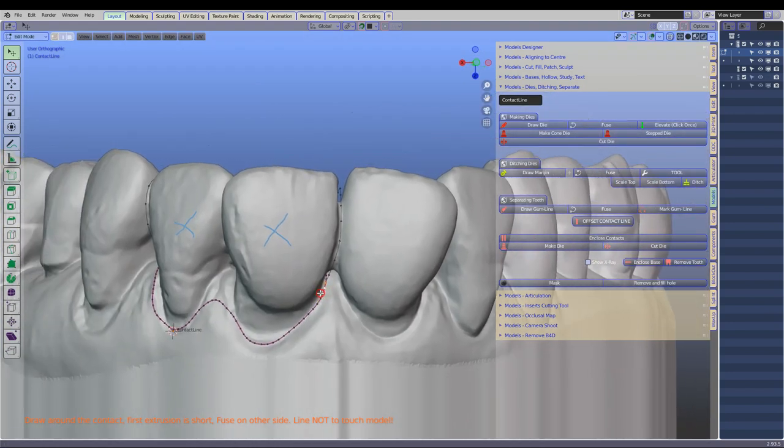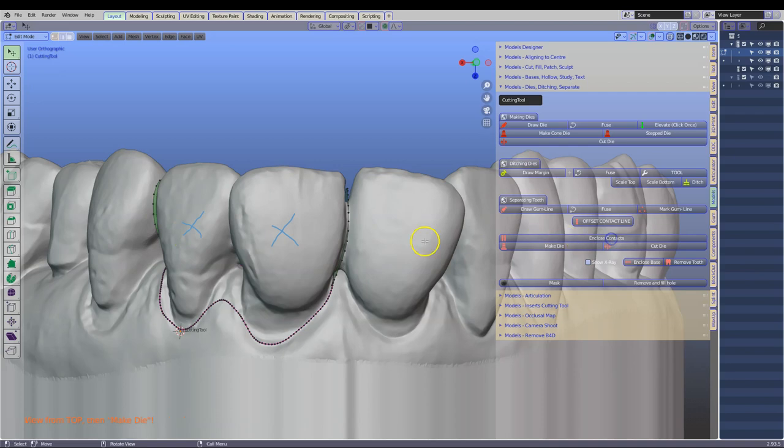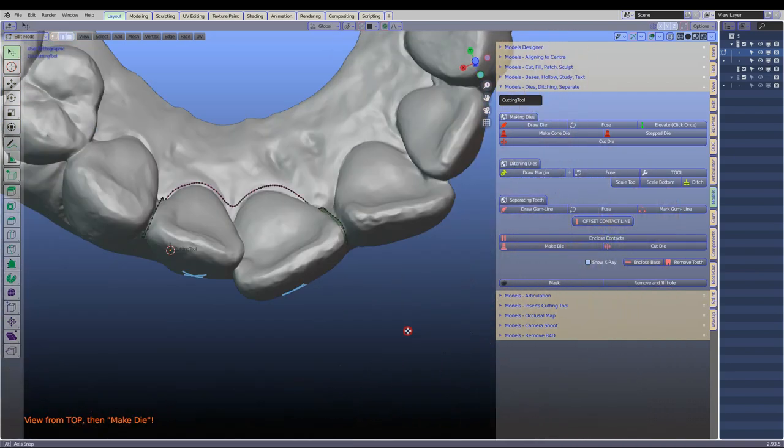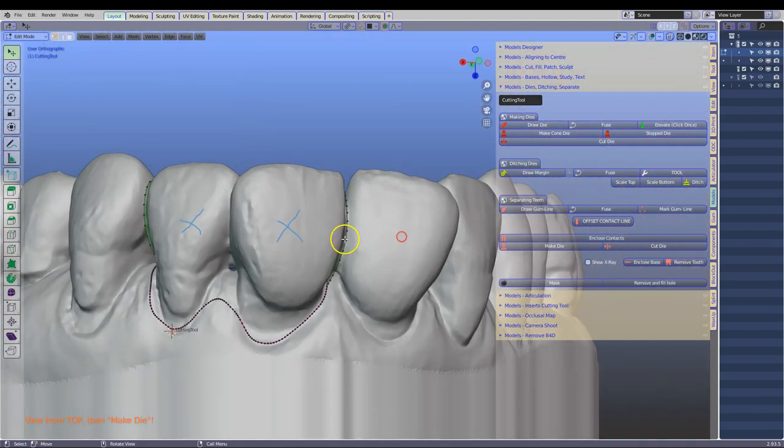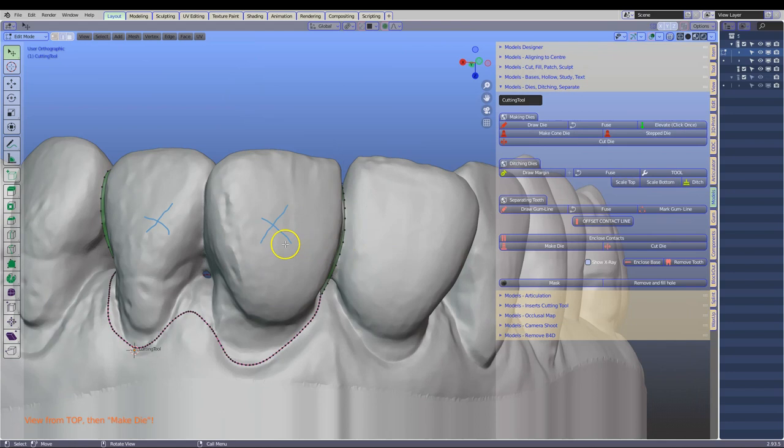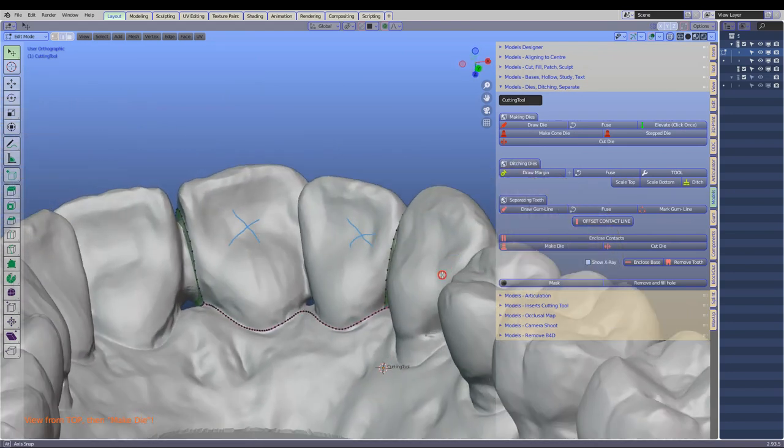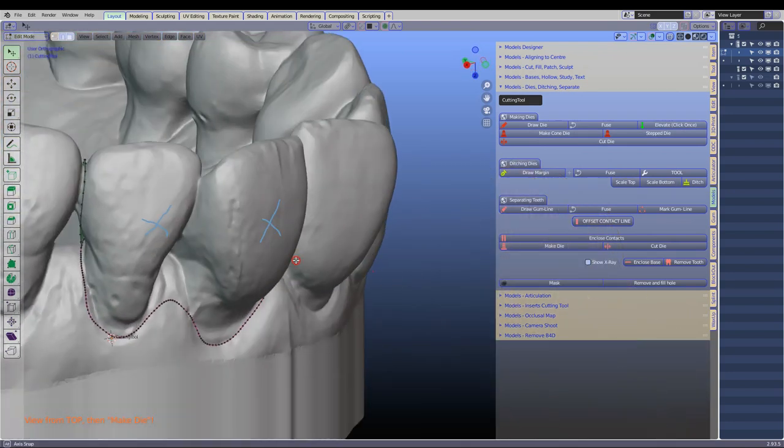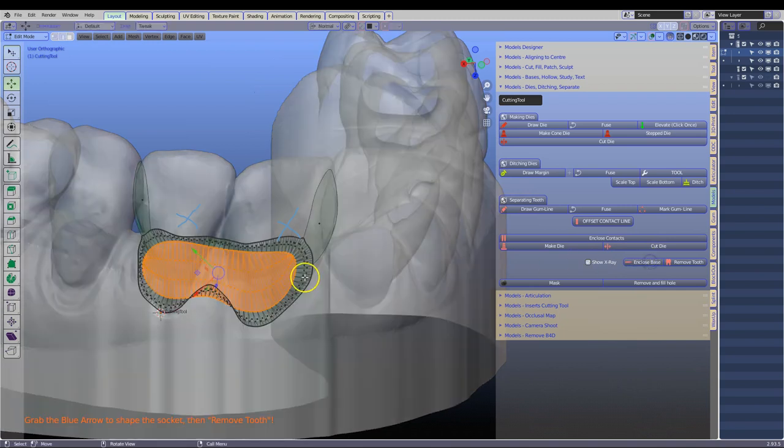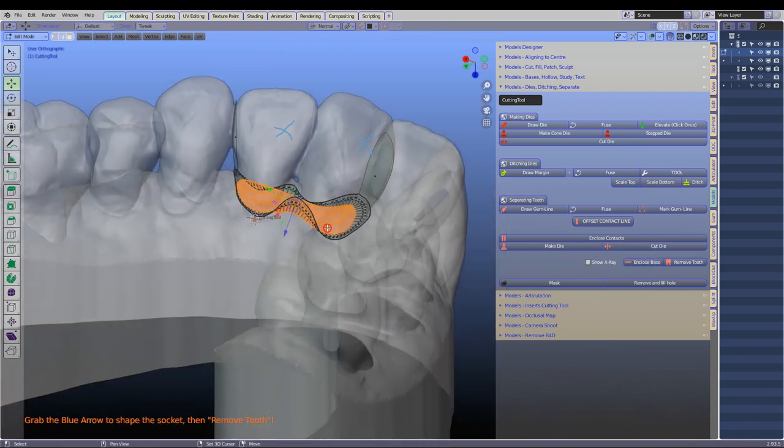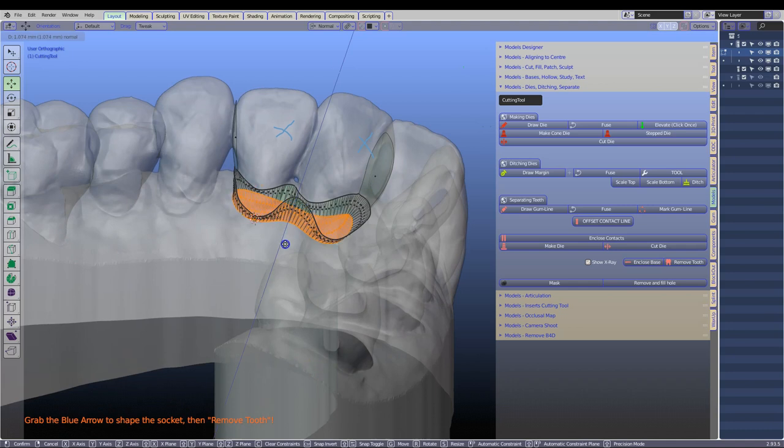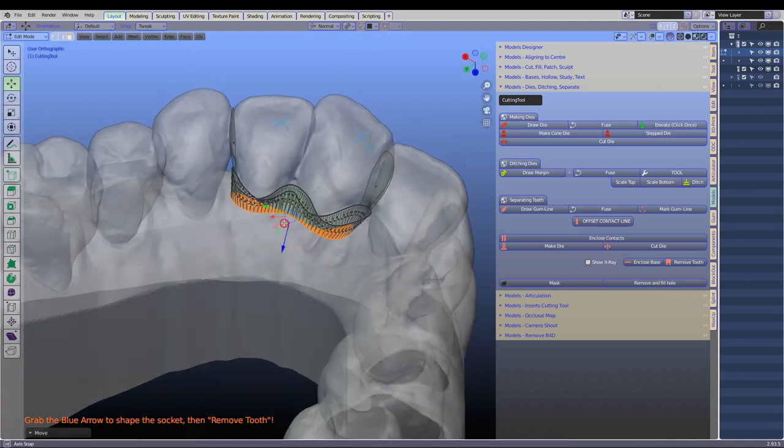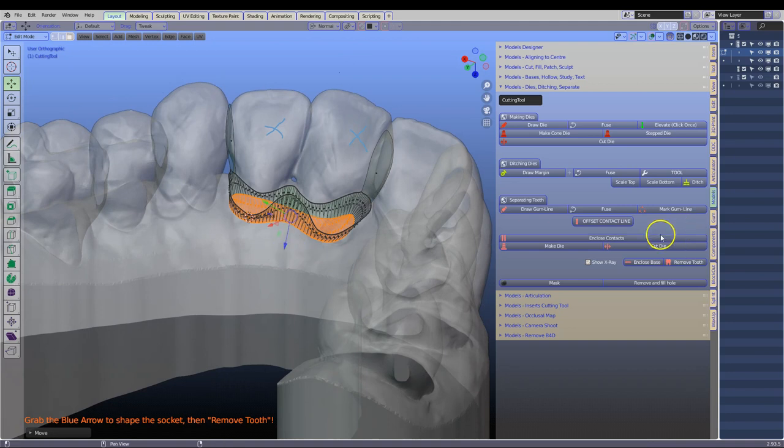This is so that the cutting tool can be above the surface. Next we are going to make these faces of the contacts. So go in close contacts. They should then appear like the screen. Make sure that the lines or the vertices are all above the surface which they are. Then enclose the base. We are in transparent mode and we are going to take this arrow and give it a bit of depth. This is so that we are socketing the model. And then click on remove tooth.